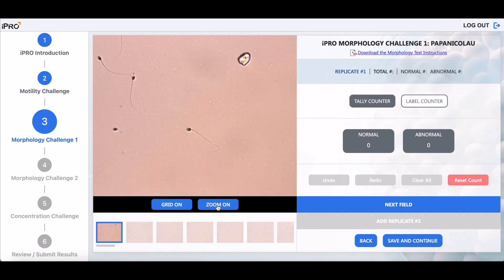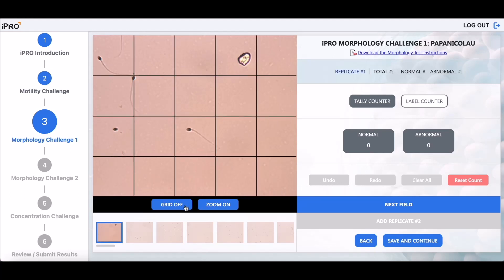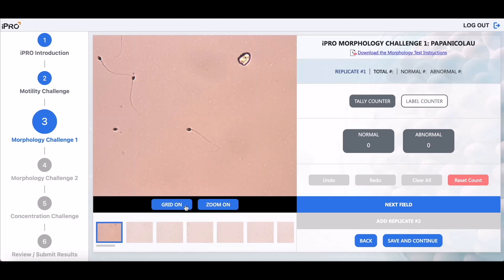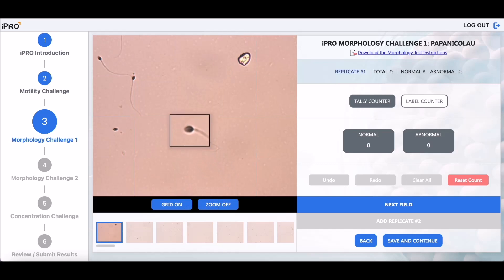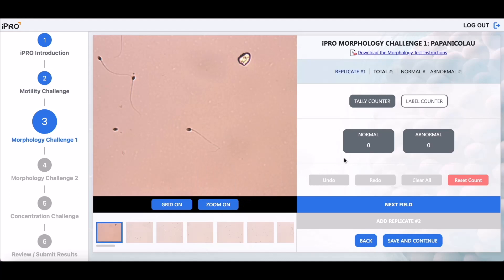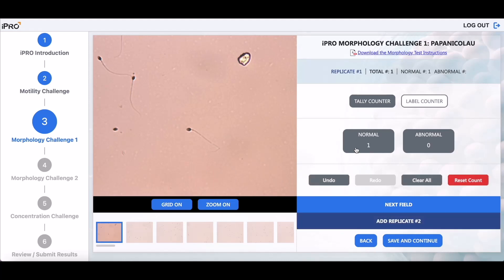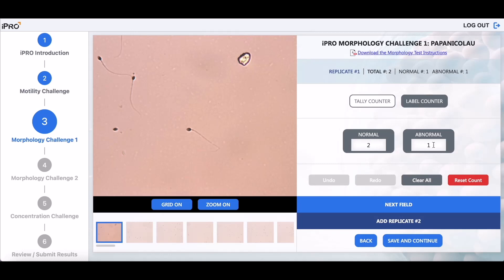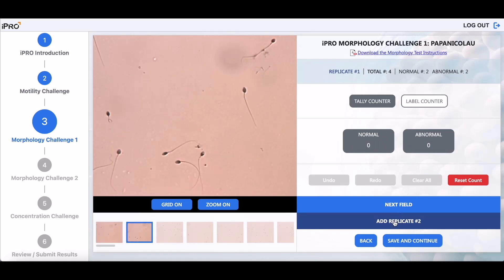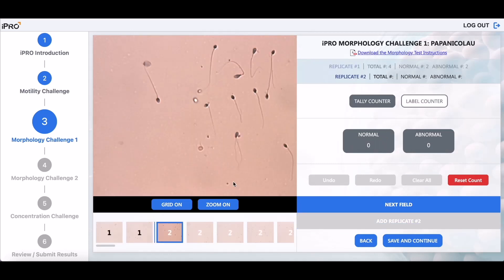The morphology challenge uses the same grid function and also has a zoom button to more easily assess sperm morphology. Count normal and abnormal sperm using either the tally or the label counter. Add the second replicate and begin counting. The WHO guidelines recommend counting 200 sperm cells twice using two replicates.